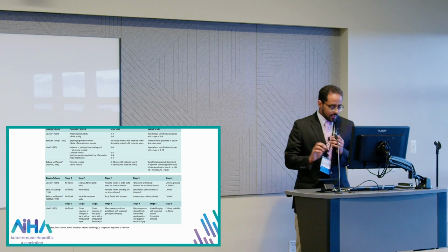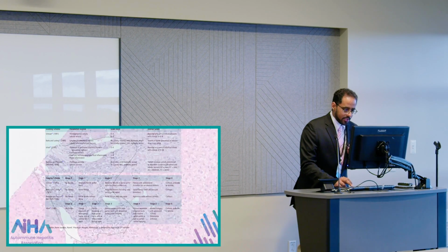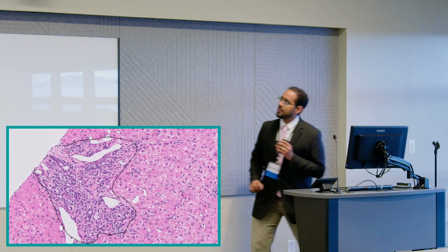So let me show you my fancy circle that I drew. It took me a long time. Okay, now that's the same.